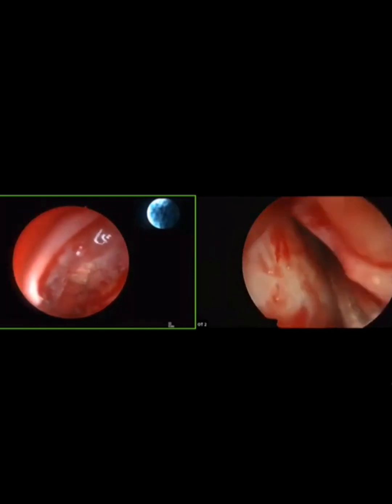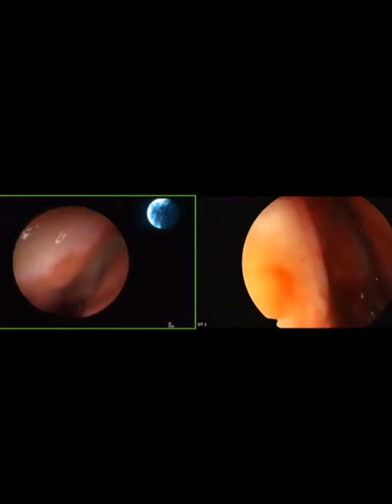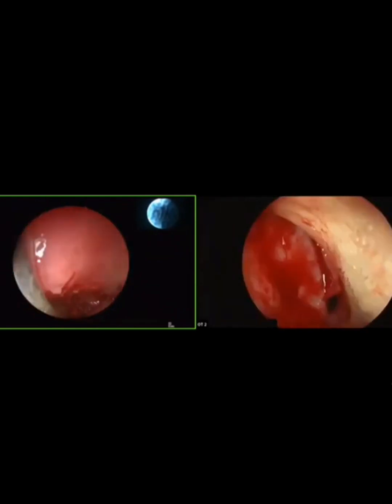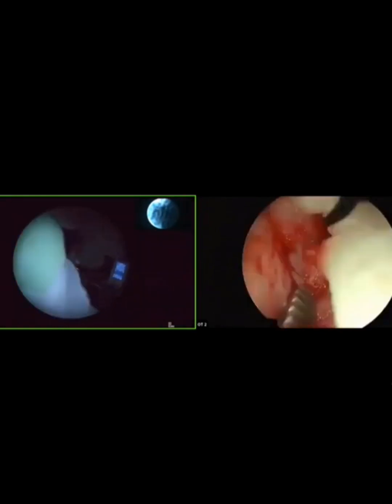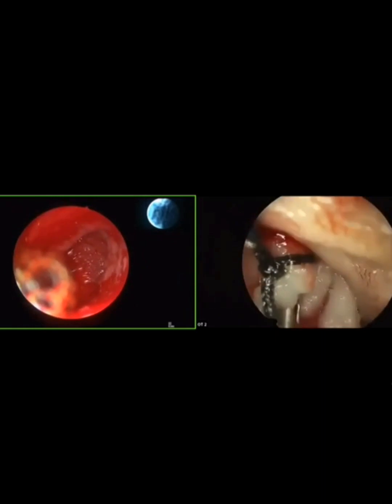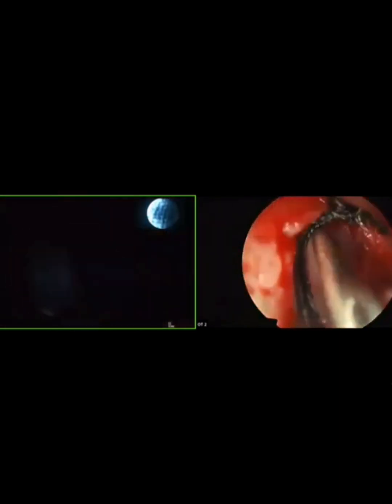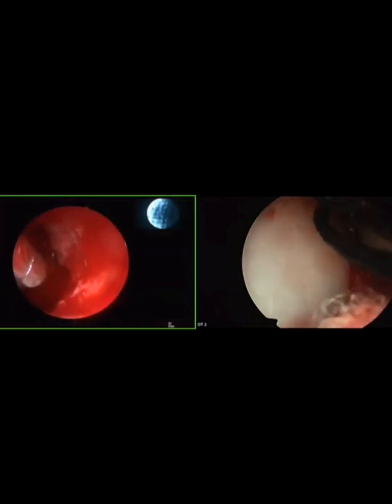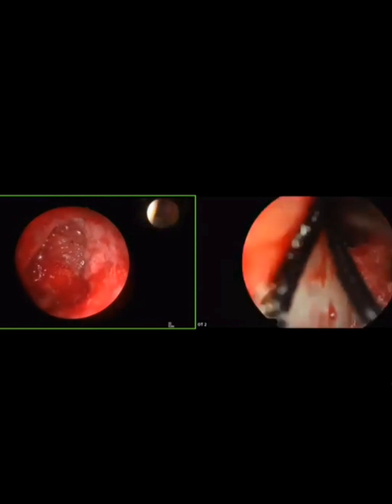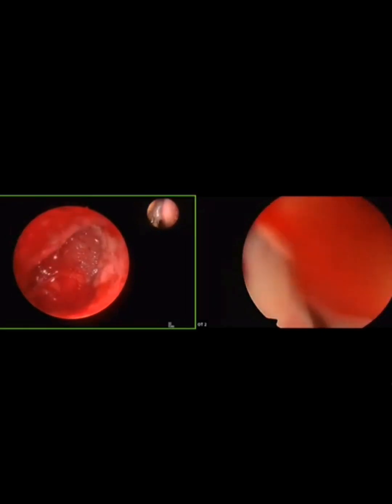Upward forceps. Give me upward forceps. Thank you. Big upward forceps, Sunil. Now I removed merocel and see inside. Wash please. Wash please. Yeah, 120 degrees. Then. See now no pus. So here is the very good role of merocel. Okay. Very good. And all these are edematous mucosa superiorly. Need not remove.